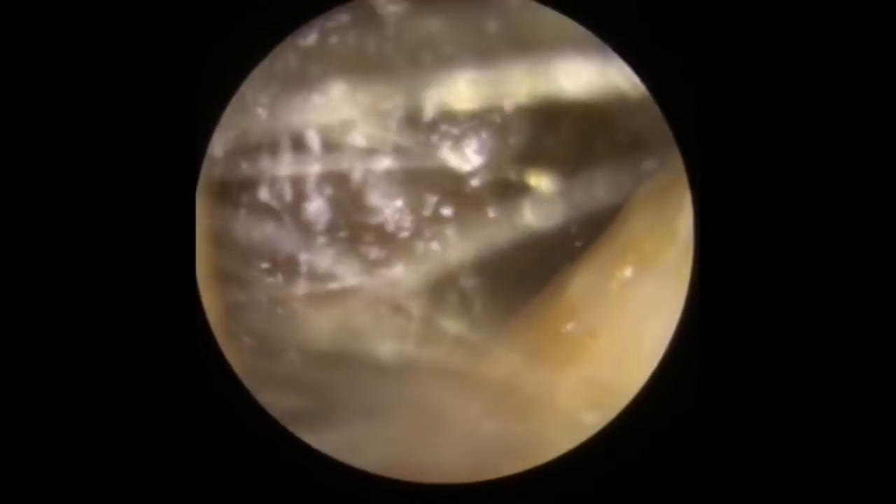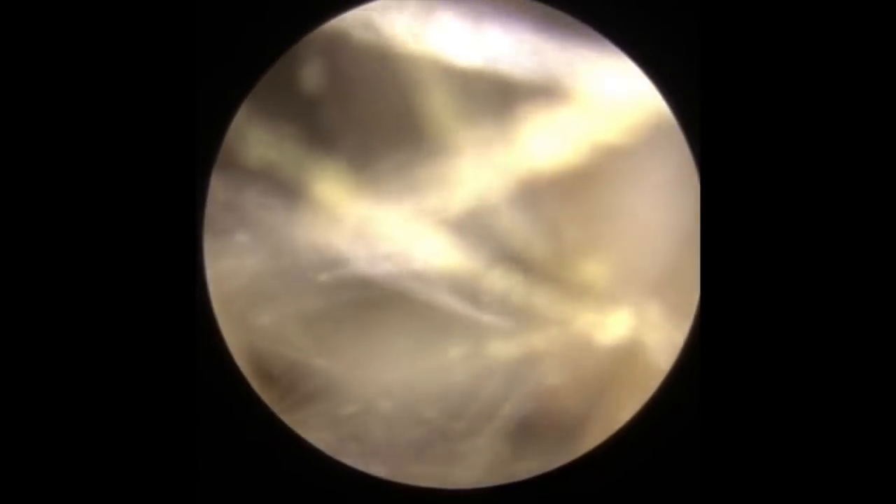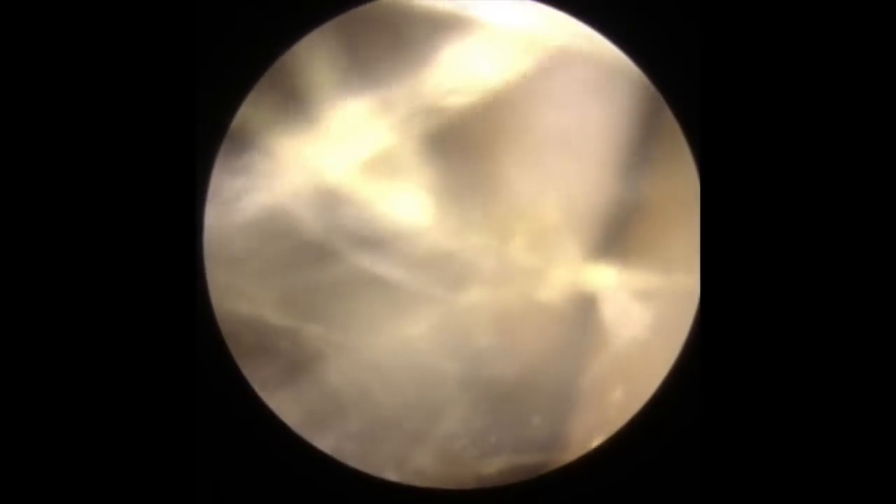This is our second patient in the compilation. This patient does have quite a lot of hair in the outer part of the ear canals, but quite large pieces of wax in here as well — I thought it was a good one to put in for you guys. The first section has a little bit of hair obscuring the view, but as we get deeper you're going to see much larger pieces of wax. This wax is darker in colour, which indicates to me it's a little bit older. Sometimes very dark wax like this also means it can be a little bit drier, giving us a much stickier, more malleable, pliable type of wax — so very sticky.